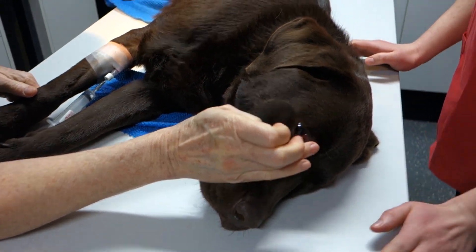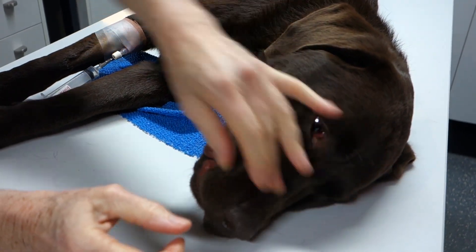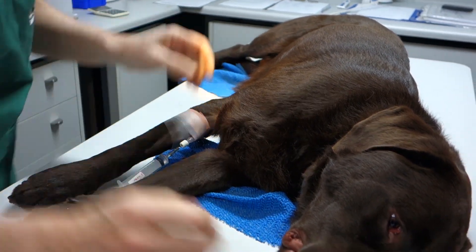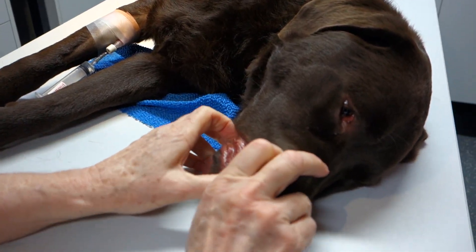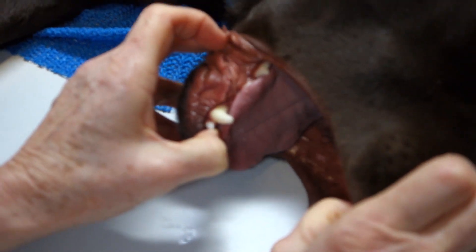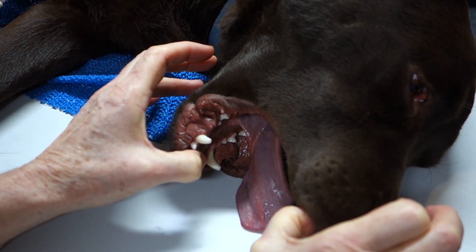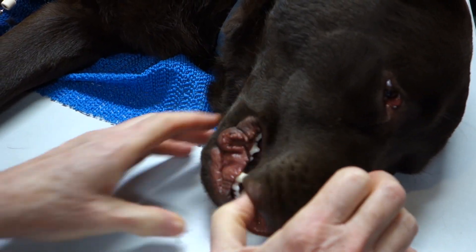We'll check the palpebral reflex — that's gone. His eye is starting to roll down. I'll check his withdrawal reflex — a good pinch between the toes — that's gone. Excellent. So we can check his jaw tone safely now, just with the tips of our fingers on his incisors, so you don't get a big canine tooth chomping through your thumb. He's got some good relaxation in the jaw tone. There is a bit of tension there, but we can probably intubate him safely. If he starts chewing a little bit or if it gets tense, we'll have to give him a little bit more.